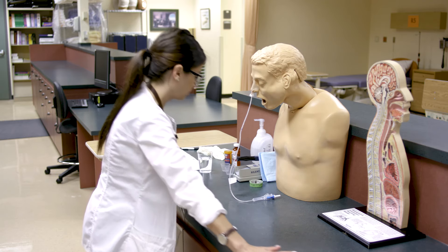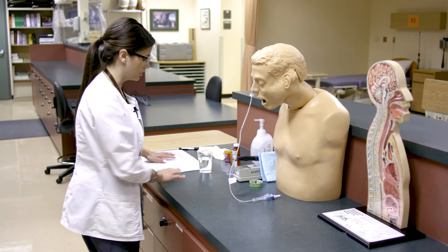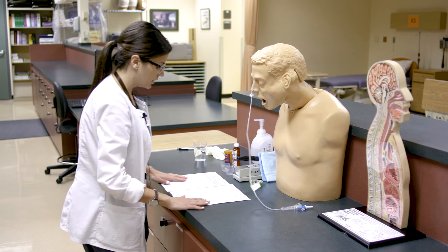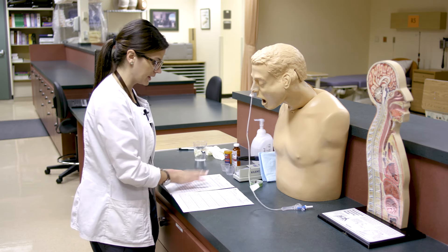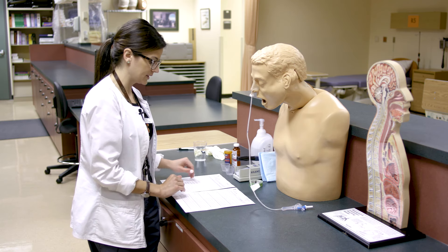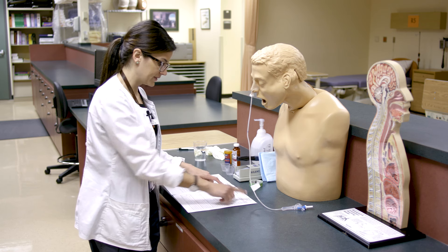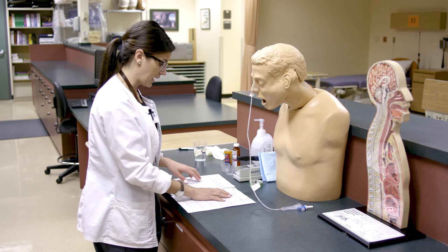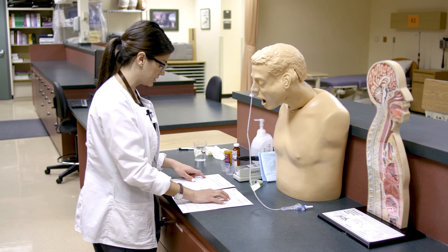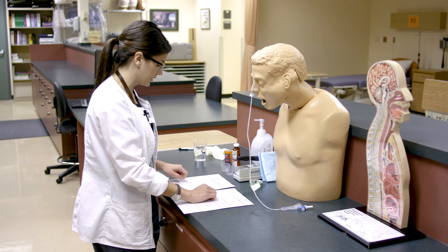We will now give meds through our Salem sump tube. Just like with any medication administration, we want to confirm that the orders match the MAR. We're checking our five rights here. The right patient is Chris McPherson, 52 years old, and the physician has ordered Benadryl or diphenhydramine, 25 mg per NG every six hours.